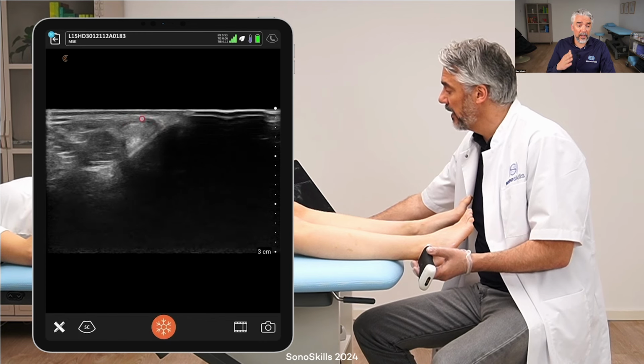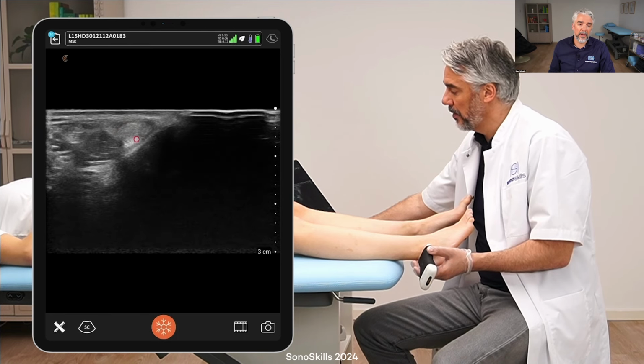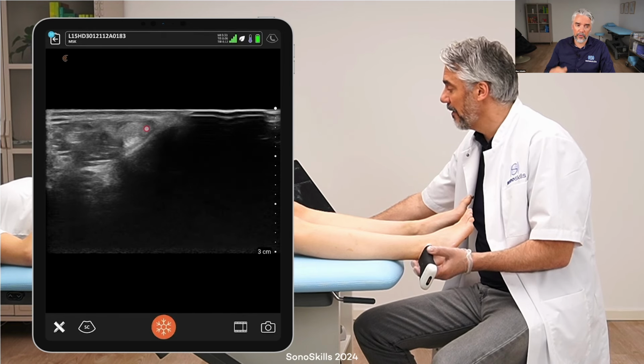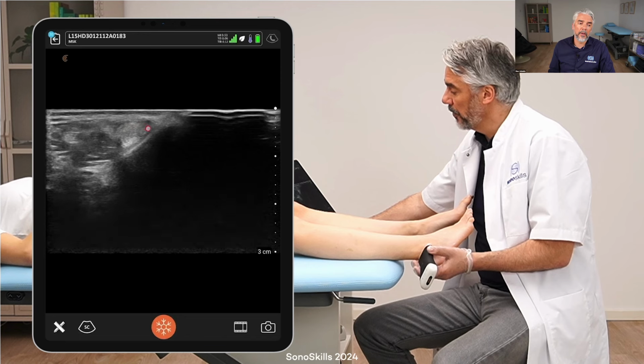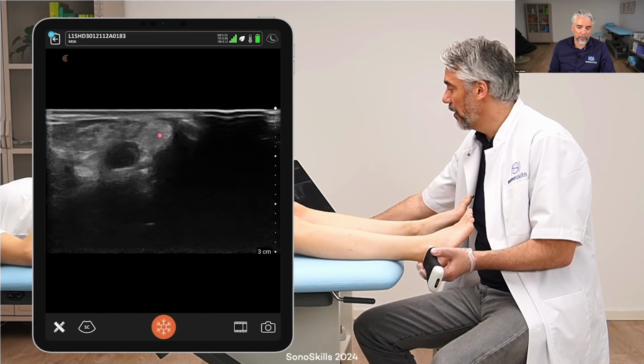And we're going to see if the tendon is located here, or maybe it's luxated. That is a possibility if the retinaculum or maybe the labrum is torn. The longus is furthest from the bone, but due to pressure, it can split the brevis in two, and then the longus is also close to the bone.